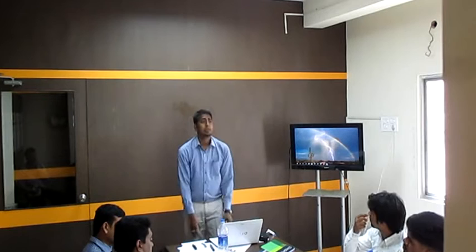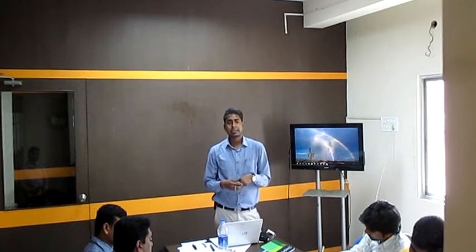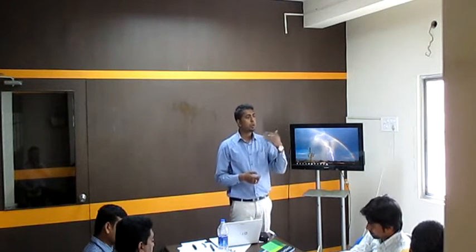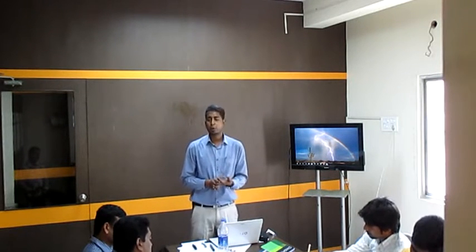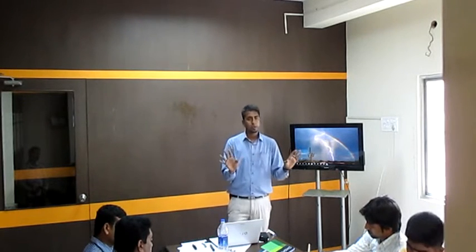The last one is high speed handpieces. That is up to 2 lakh. Anything beyond 40,000 is known as high speed handpieces. Got it? That is how you can classify on speed: 12,000, 40,000 and beyond 40,000.